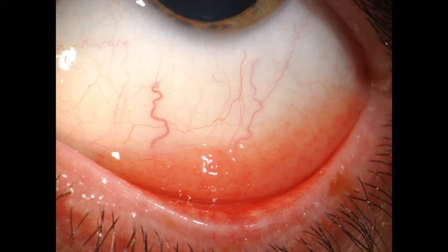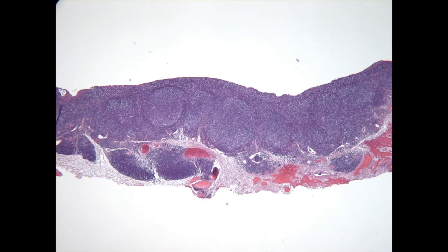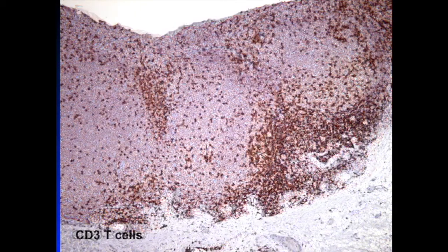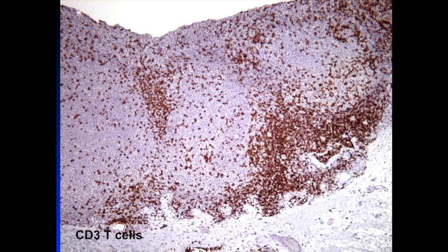Here's an example. This case has a pebbly appearance, and this case does have germinal centers. This shows the immunohistochemistry, the B cells comprising the lymphoid follicles with the intervening T cells shown by positivity for CD3.